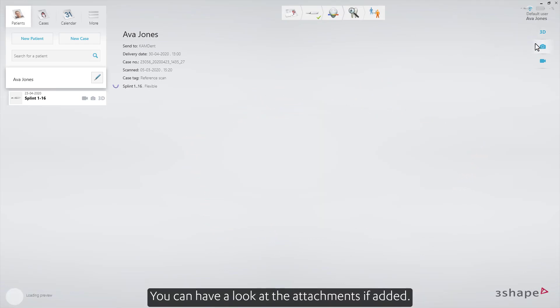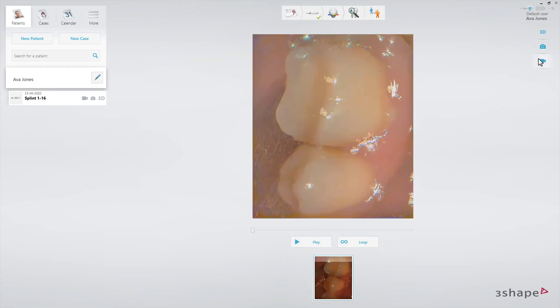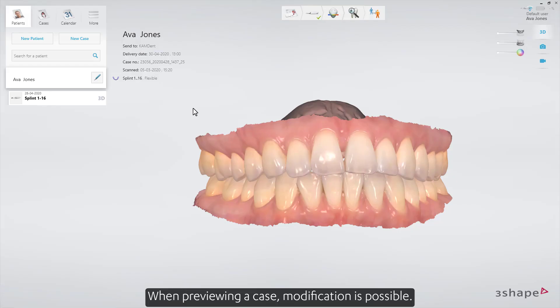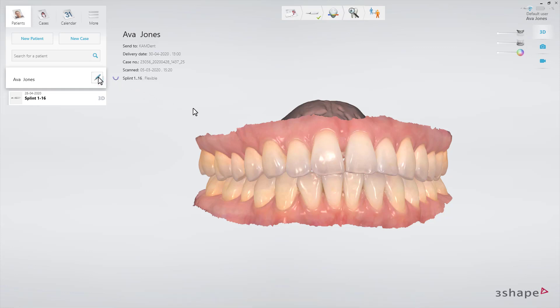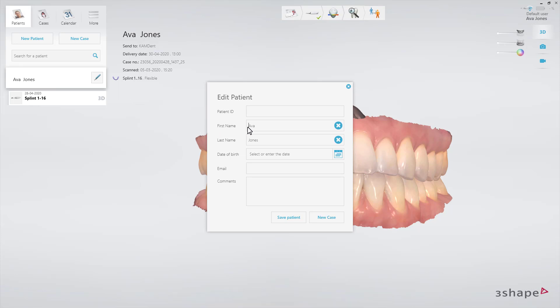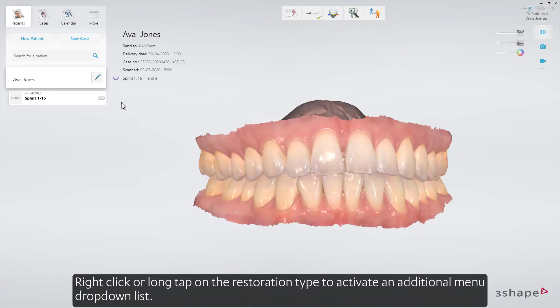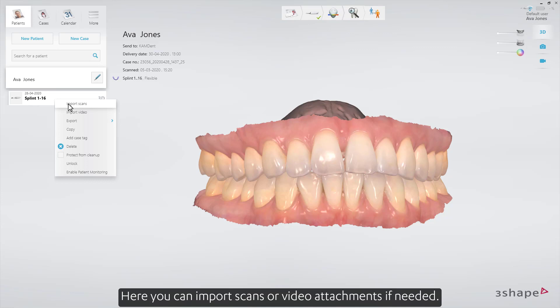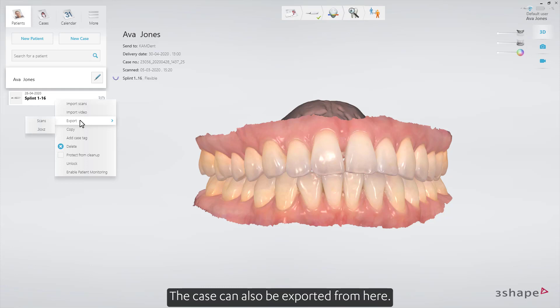You can have a look at the attachments if added. When previewing a case, modification is possible. The patient's details can be edited. Right-click or long-tap on the restoration type to activate an additional menu drop-down list. Here you can import scans or video attachments if needed. The case can also be exported from here.